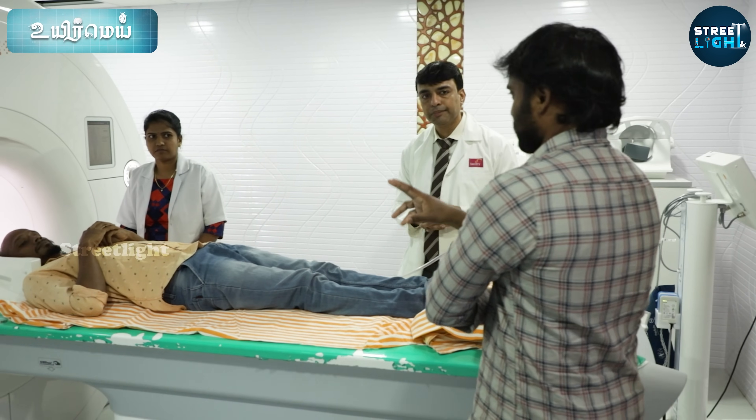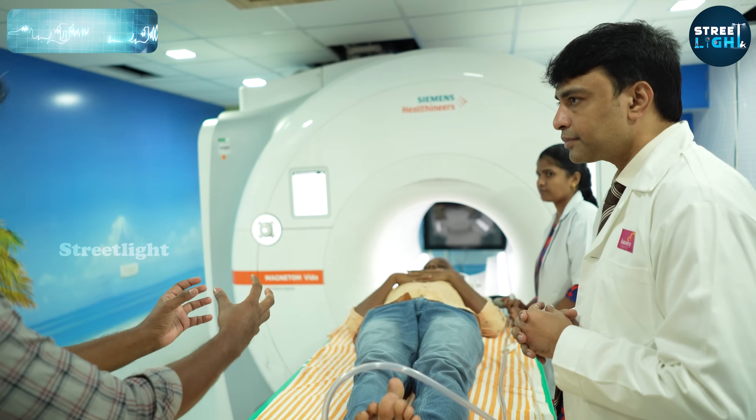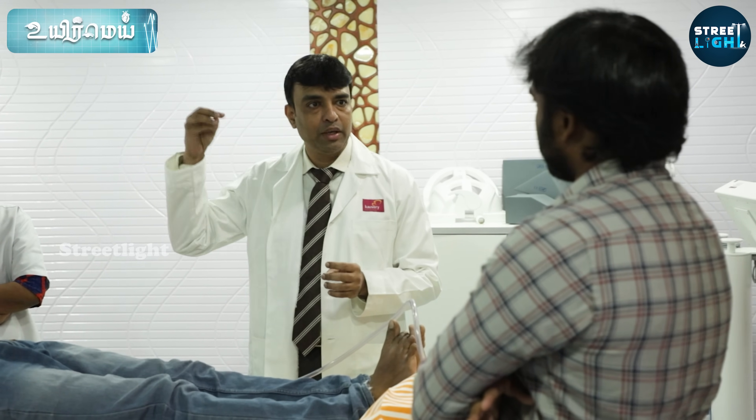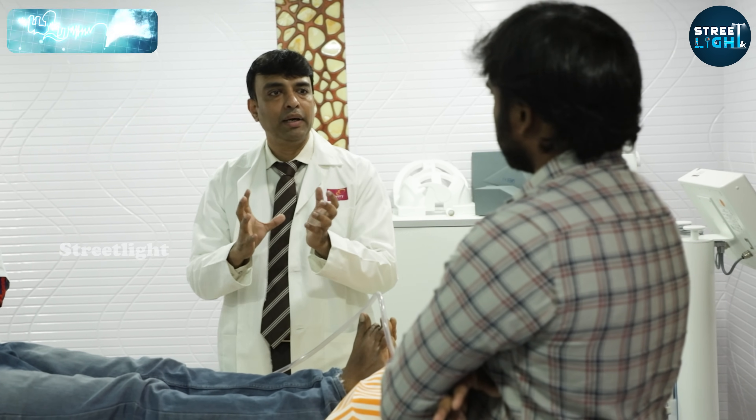How does MRI work? It's complicated physics, but the magnet creates a magnetic field. We apply radio frequency in that magnetic field. In our body, there are hydrogen atoms and other elements. They orient themselves in the magnetic field, and in that way we can capture the image.